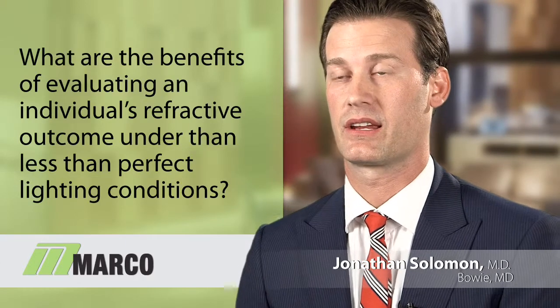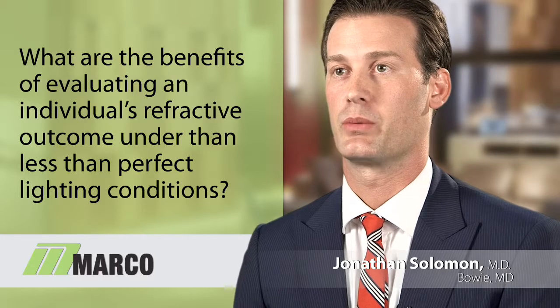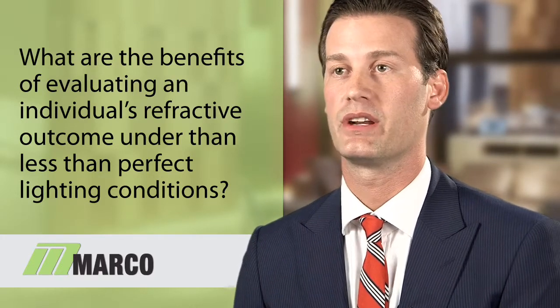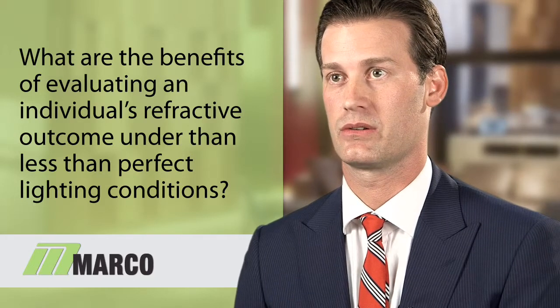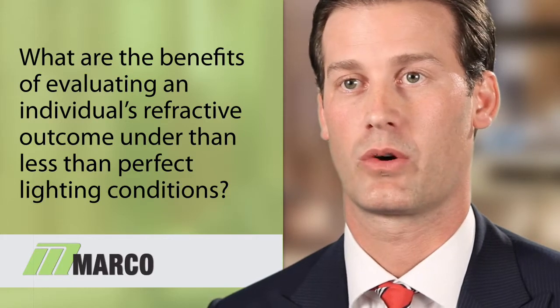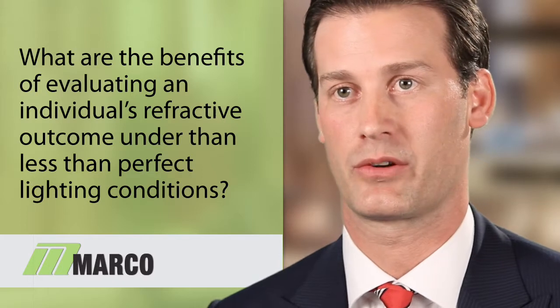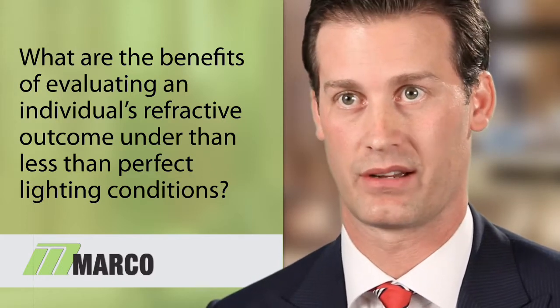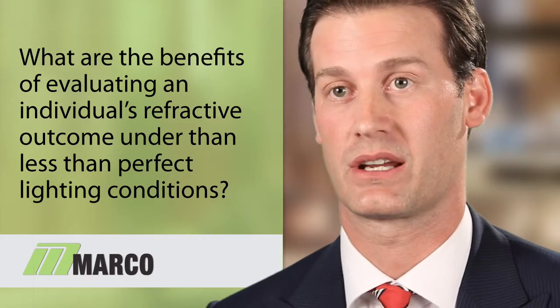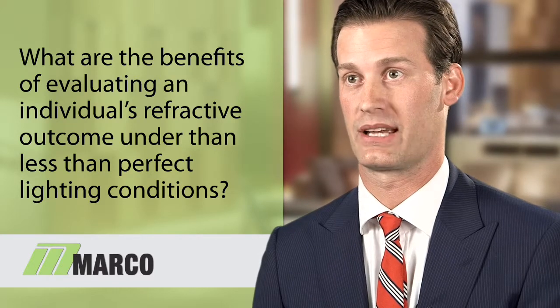A case study that I think certainly illustrates what I am alluding to would be a patient, for instance, who has a toric implant. The beauty of the OPD-3 is that it gives you not only information with regard to the front of the cornea, but quite a bit of information with regard to how light passes all the way to the back of the retina, even beyond the surface of the cornea, i.e. either the back of the corneal surface or, in the case of a toric lens, the actual location or orientation of the implant itself.